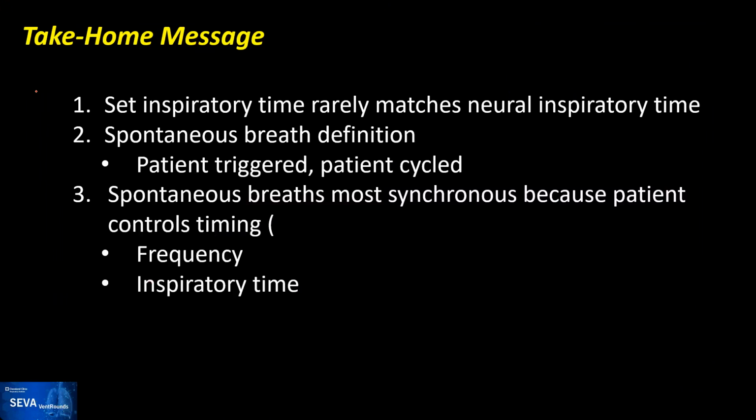Usually, when we set the inspiratory time, we set it arbitrarily, and it's always going to be the same time, the same monotonous time, versus the neural inspiratory time, which is highly variable. And a spontaneous breath, by definition, cannot be a breath triggered or cycled by the machine.